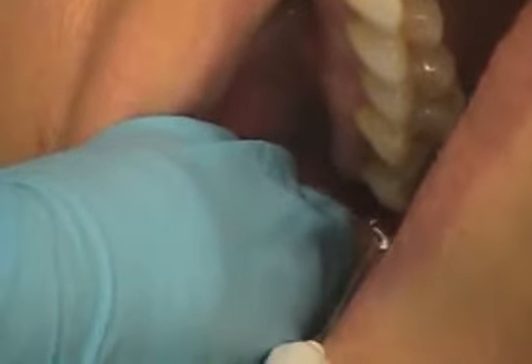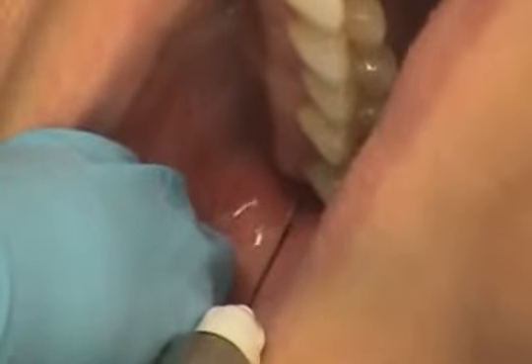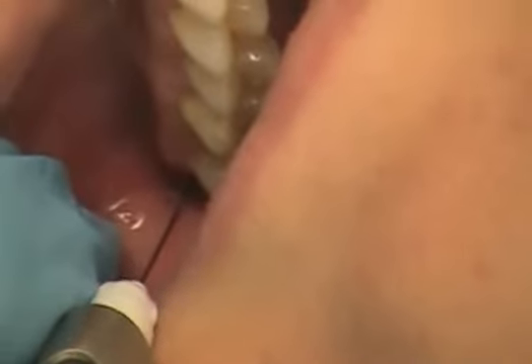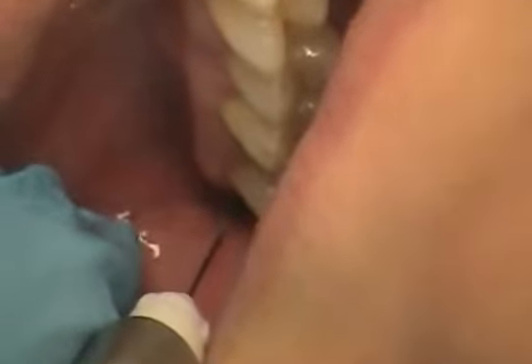and the target area is the PSA nerve, which is posterior, superior, and medial to the posterior border of the maxilla. The syringe position is upward, inward, and backward, maintaining a 45-degree angle. Insert the needle to the height of the mucobuccal fold over the second molar. The bevel orientation faces towards the bone. There is no pressure anesthesia.